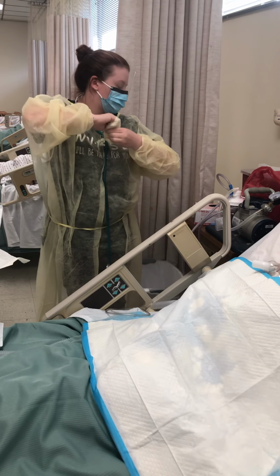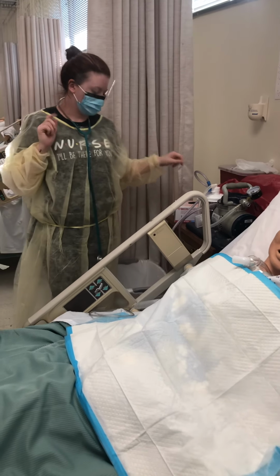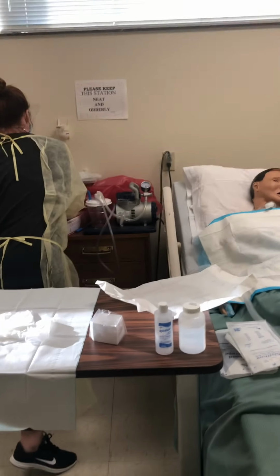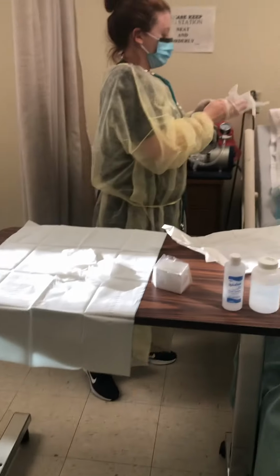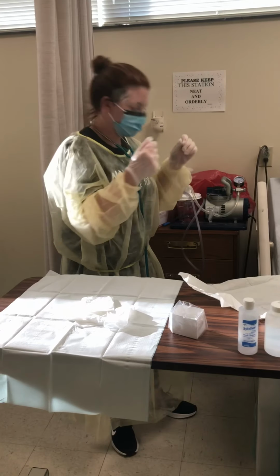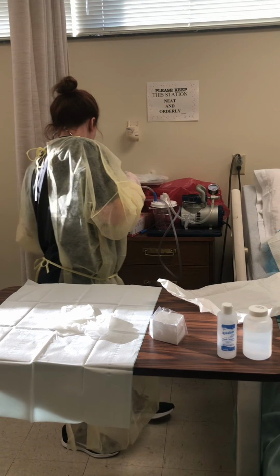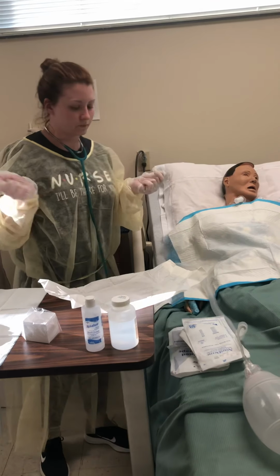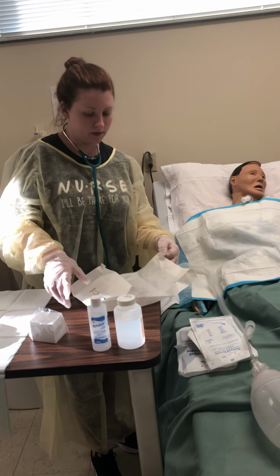And this goes into the biohazard bag. Next, I'm going to put on some clean gloves. And take off my face mask. And I'm going to go ahead and clean up the rest of this.